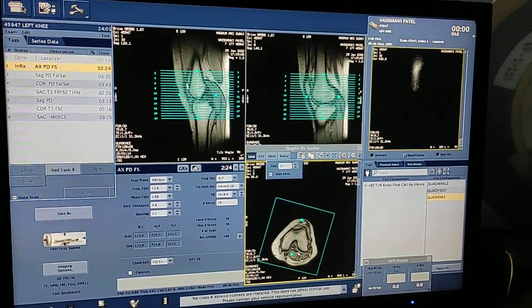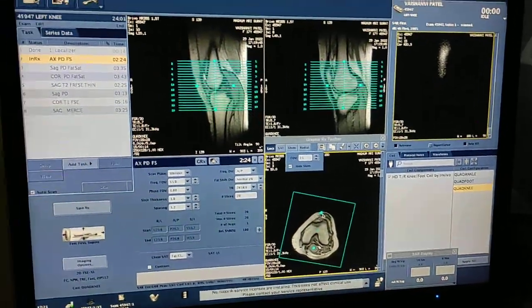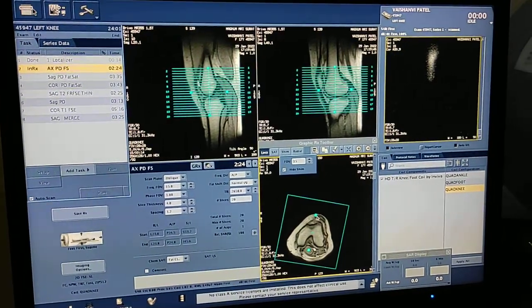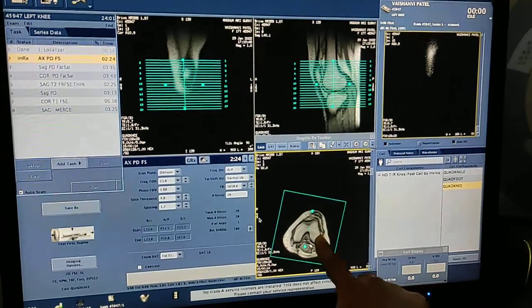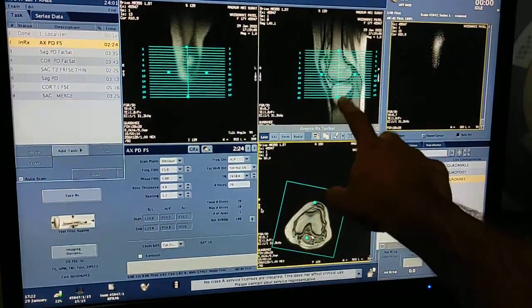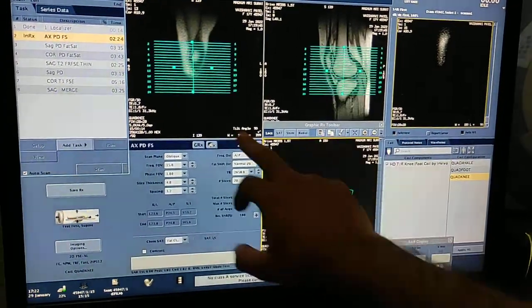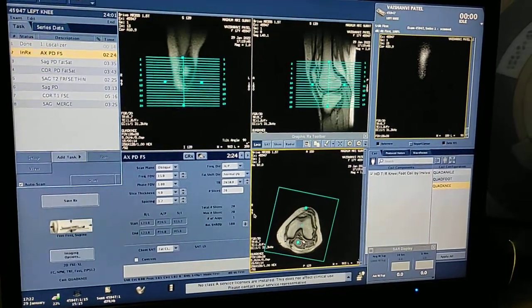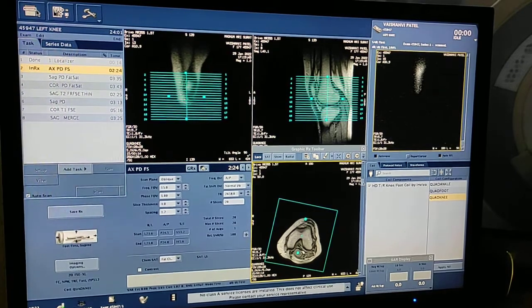This is the angulation of the axial image — you can see this box. Always remember: if you want an axial image, you have to plan on sagittal and coronal. If you want coronal, plan on sagittal and axial. If you want sagittal, plan on coronal and axial. Keep this in mind always. So first of all I am starting axial FS PD.